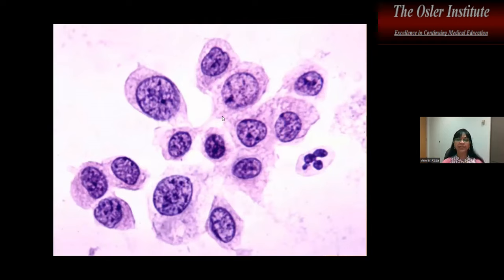Now, what about dysplasia? What are some of the clues of dysplastic nuclei? Look at this. You have a high nucleus to cytoplasmic ratio, the nuclei even touching the cytoplasm. It's just too much nucleus for cytoplasm, marked pleomorphism. Then you look at the chromatin. It's irregularly clumped. You can start seeing abnormal shapes, maybe banana, star-shaped, etc. And if you were to divide these into quadrants, the chromatin is so irregularly clumped that you don't have the same pattern in all the quadrants.